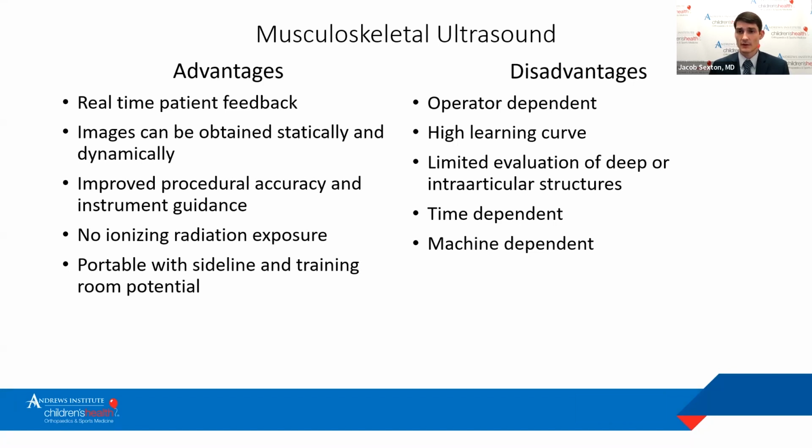One of the biggest benefits is that it does not involve ionizing radiation, as opposed to CT scans, X-rays, and plain films. And then finally, the machines are becoming so functional now that they're becoming portable, so they have potential sideline, athletic training room, and outside-the-clinical-office applications.